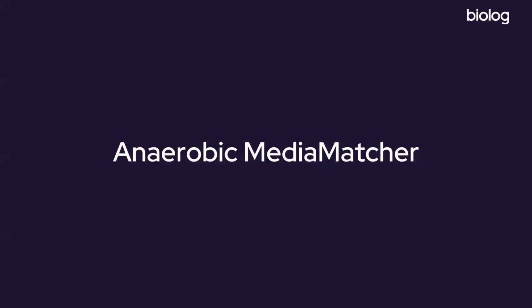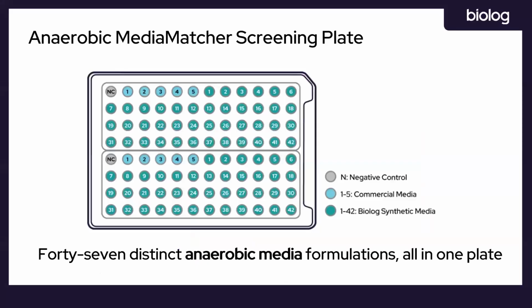Now that we covered the basics, let's look at the anaerobic MediaMatcher. As mentioned earlier, culturing obligate anaerobes, such as those found in the gut microbiome, requires extensive media optimization.